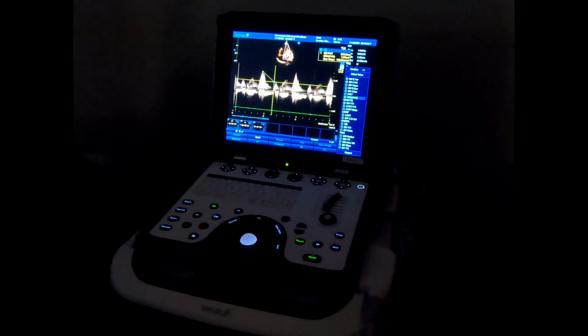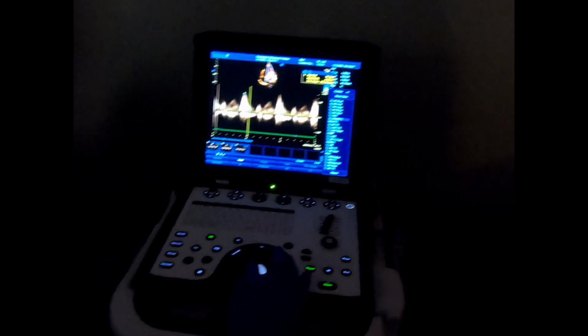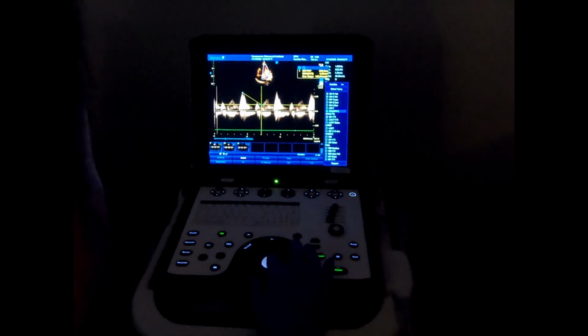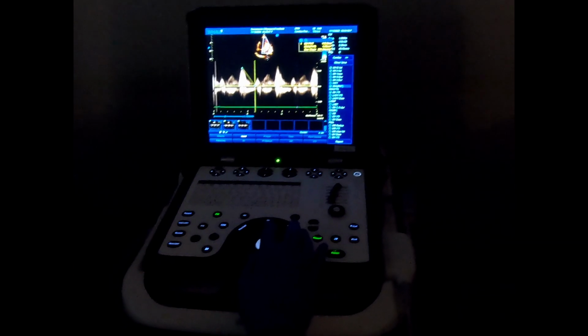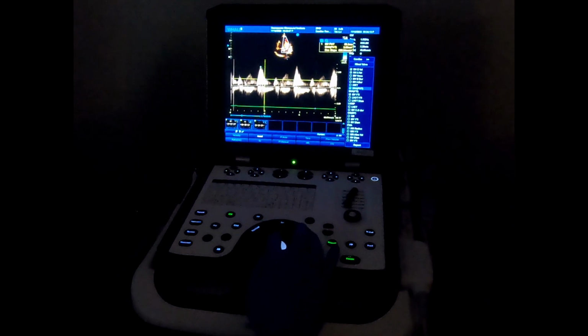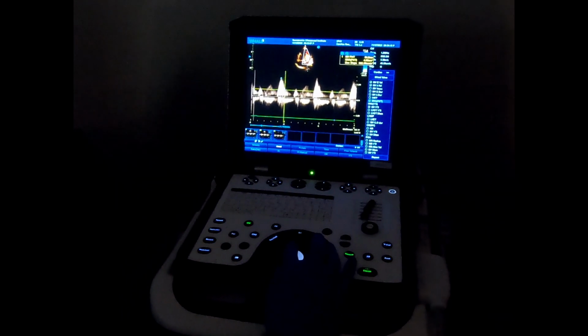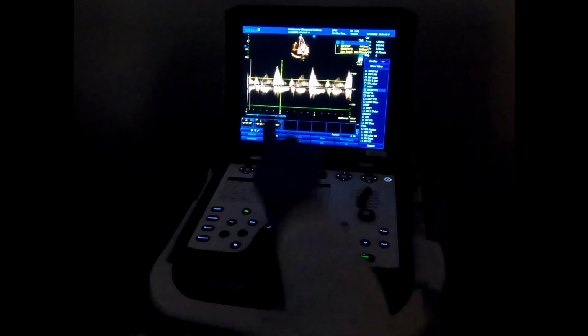Now, what if you were doing deceleration time and you have the lower bottom? Again, same thing. You need to exclude this little flow. You shouldn't follow like this. This is not deceleration time. This is deceleration time. For pressure half time, you need to stay here. And that next wave would be the A wave connected to it? Yes, this is the A wave.